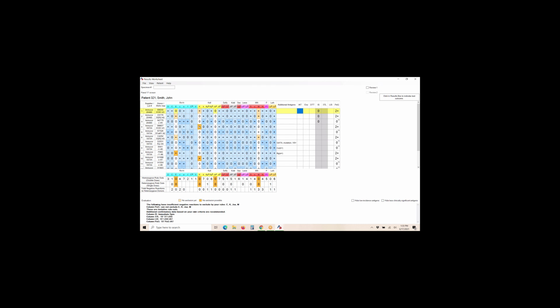So it appears that there's an anti-K. It doesn't conclusively say it's there, but it's pointing strongly in that direction. And similarly with number 10, which is number 7 from that Immucor 19734, you have the same thing, and for big E, you have the same thing happen on number 9.